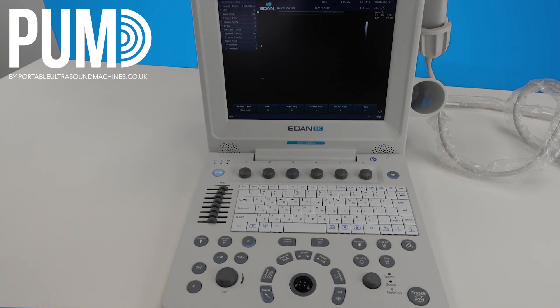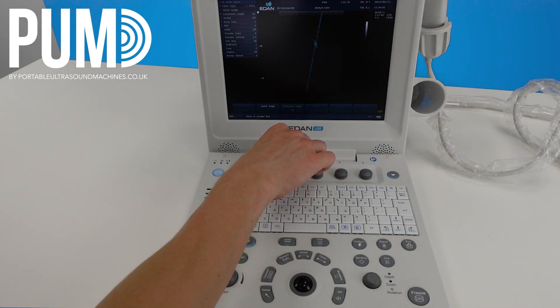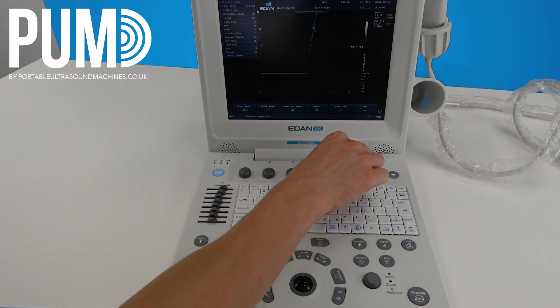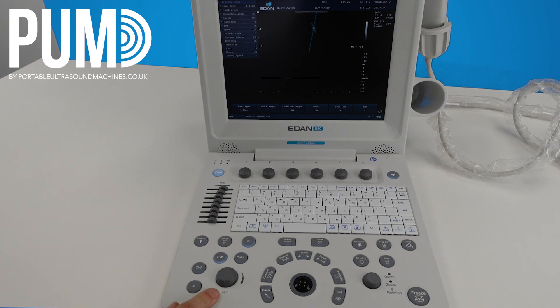The pulse wave and continuous wave work the same — simply hit it to bring up your cursor. You can adjust the cursor using the trackball. You have an angle correction which you want to line up with the direction of the flow, and once you're happy hit PW again to start the trace. At the top you have your baseline which you can adjust, and your PRF to adjust the scale. Note your gain will still work in these modes, so you can adjust the gain of your PW Doppler trace. B will always take you back to your 2D image.